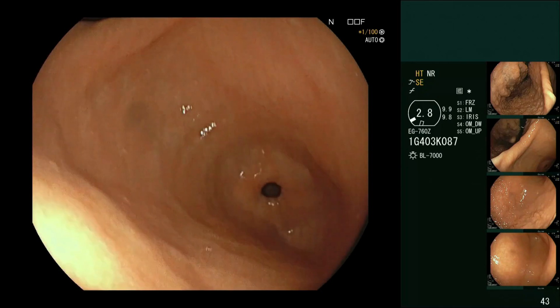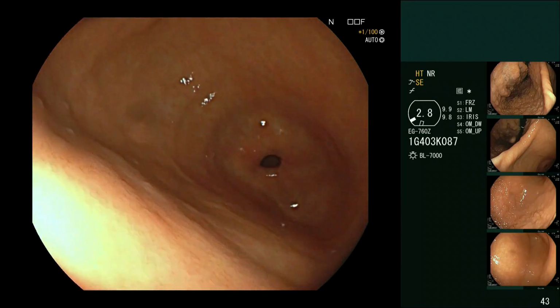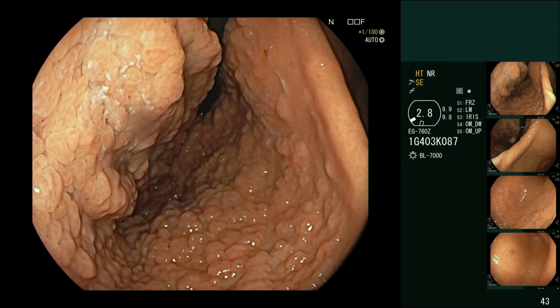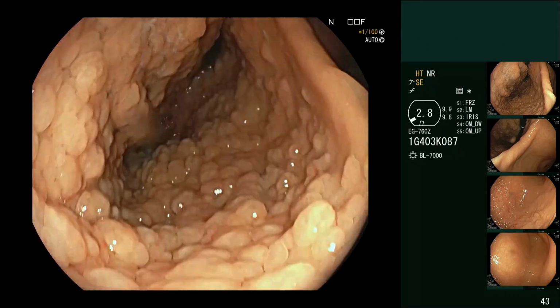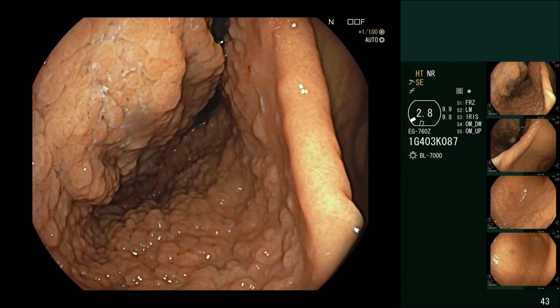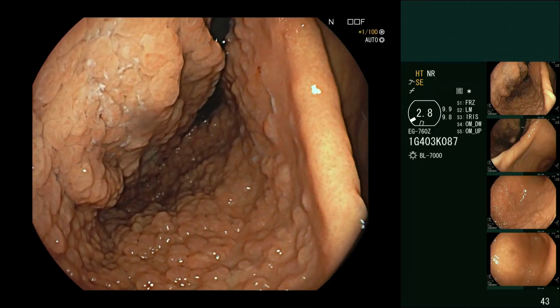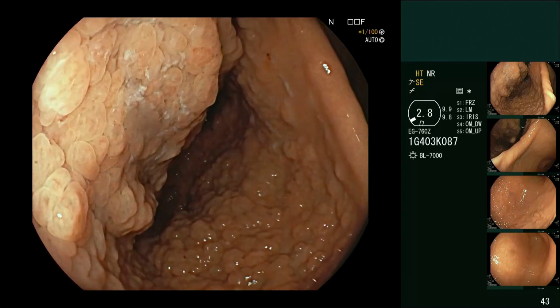Right, so we dealt with the antrum. Now we're talking about standardized photography. We didn't even get to biopsy yet. Photography of the rest of the stomach. So the key problem here is that this stomach will be surveyed probably every 6 months. And the question is, well, what is changing? What is there? What is not there? What was there before?